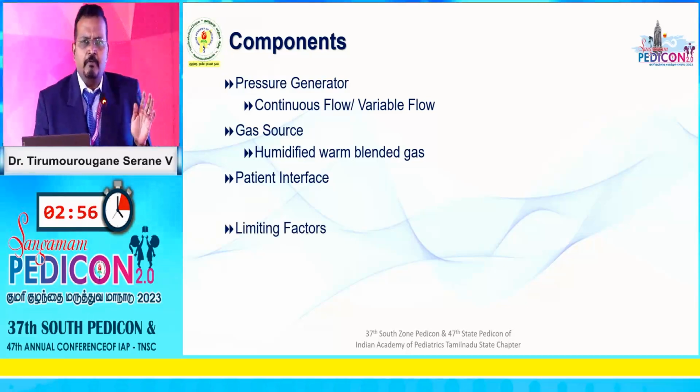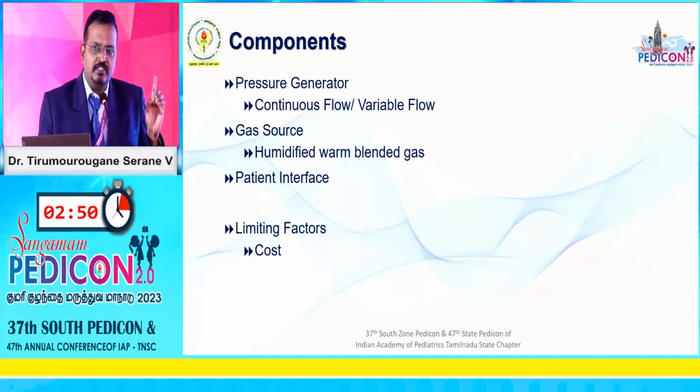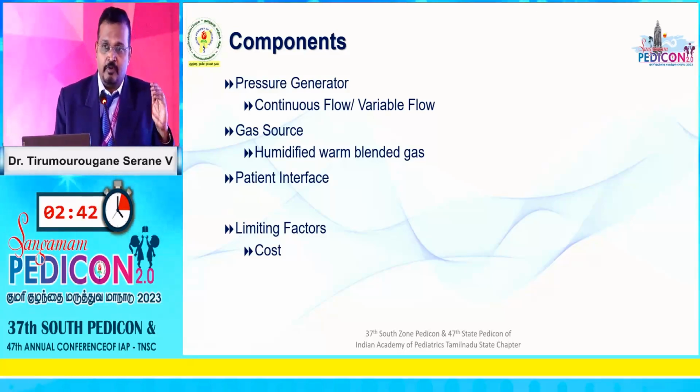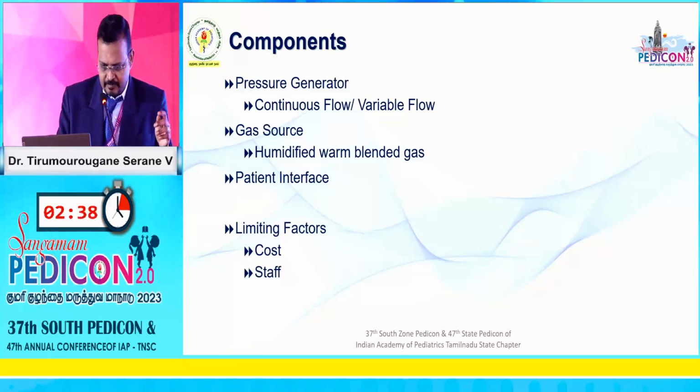Now, what are my problems? Why should I continue using it? Okay, so what will stop me from using a CPAP? The most important thing is the cost. Generally, constant flow devices are much cheaper, but even they are very expensive. They are not that cheap. They are still expensive when compared to all the synchronized modes and then NIPPVs.